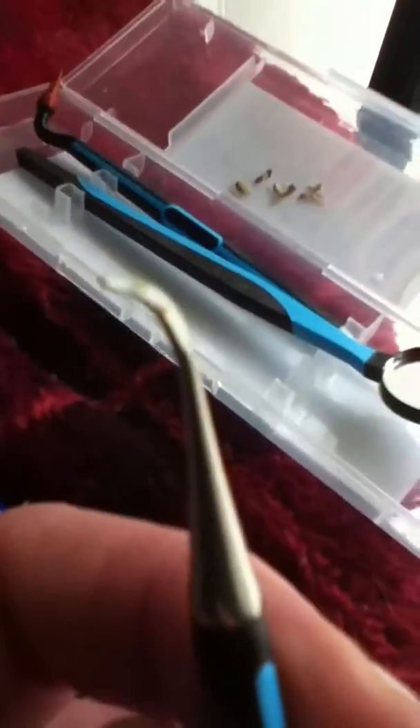I don't recommend everybody do this at home, but for those of you who have a good calm dog that will sit still — she's on a table, we're in daylight — use the flat side, not the sharp end, so you don't hit their gums. That flat side is what I used and it came off quite amazingly well.